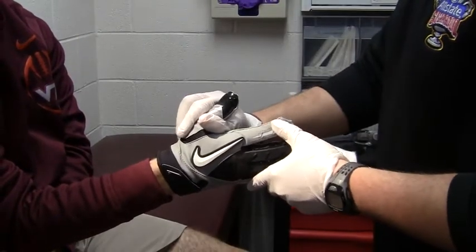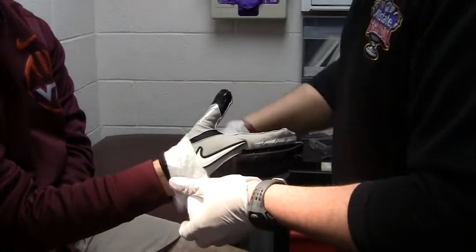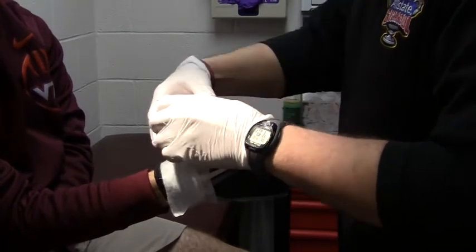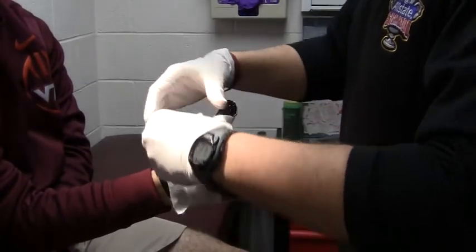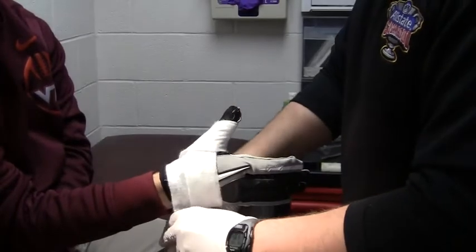When applying the casting material, make sure the athlete is wearing a glove if they plan to do so during competition or practice. Apply the 2-inch cast padding in a figure-8 pattern, making 1 circle around the base of the thumb and 1 circle around the wrist. Make sure the entire area is covered.